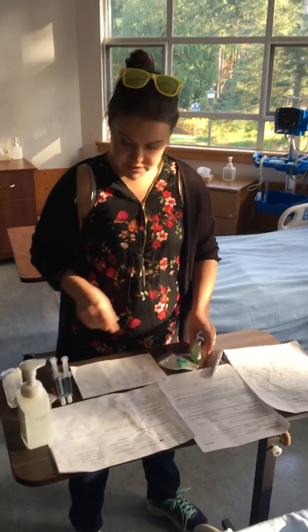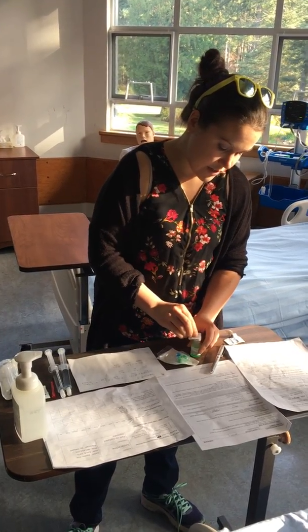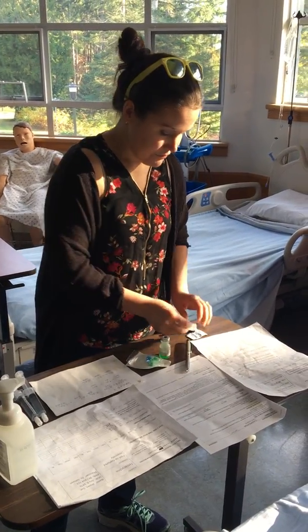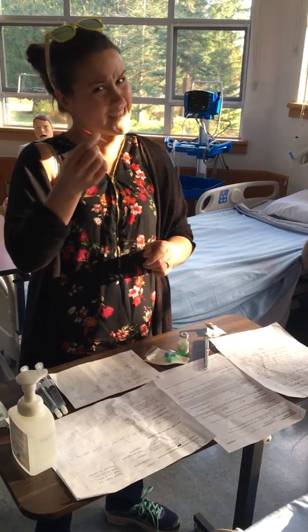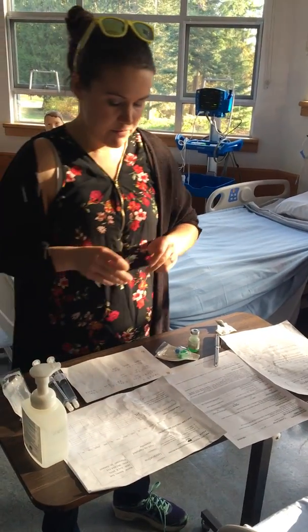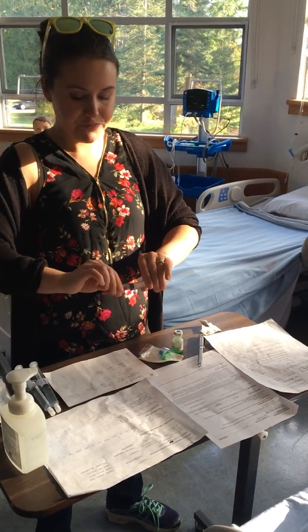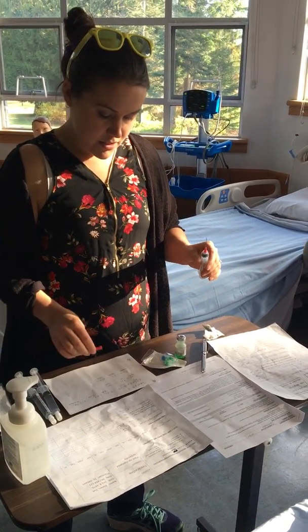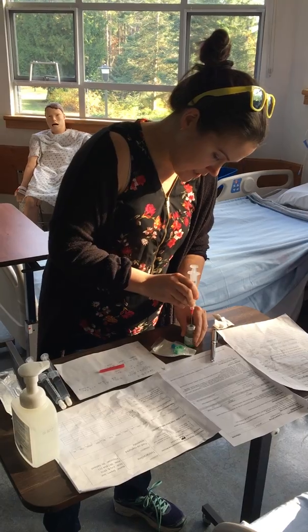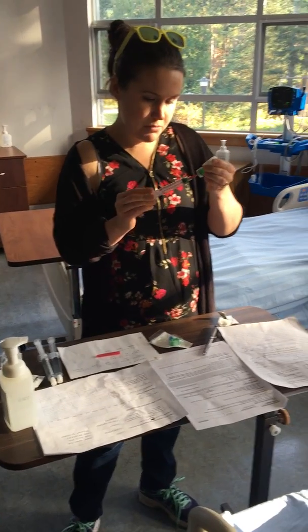Okay, perfect. So now that I've done that, I can open up an alcohol wipe and clean the top of my vial for 30 seconds. Then I'm going to open up a brand new needle and open up a brand new 10 ml syringe so I can draw it up. I'm connecting them, not touching this, in order to maintain sterility. I'm going to uncap and draw up 1 milliliter of air. Inject the air into here. Then draw up 1 milliliter of medication.